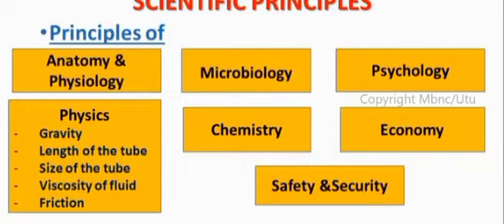Sixth principle, that is the principle of economy. Economy in terms of less time and money. First, we have to give the proper position for the insertion. Second, we have to collect all the articles near, that is easy to access and available. Then perform the procedure as quickly as possible, so it reduces the time, and it will save money also if we give the proper position and do the insertion at one time.